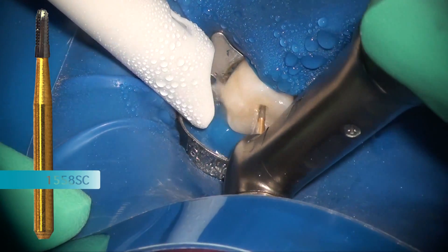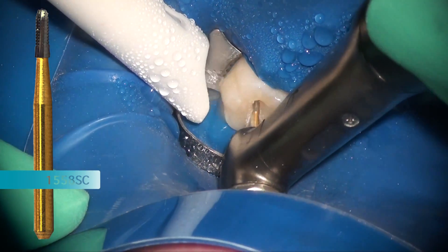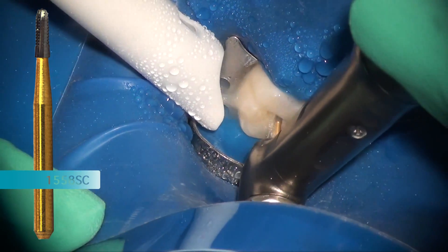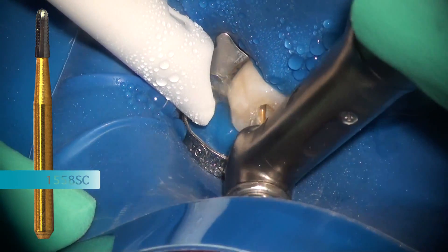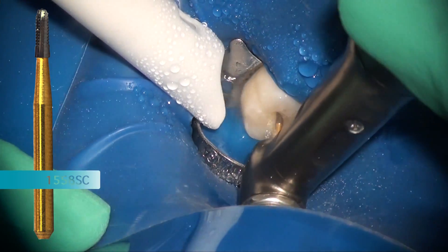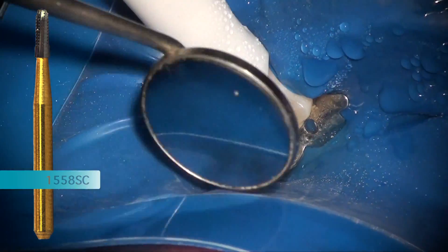Using the Brasseler electric handpiece, this bur is able to make a very quick preparation. Following the outline form, we go down through the composite and just a tiny bit more and we can get into the pulp.